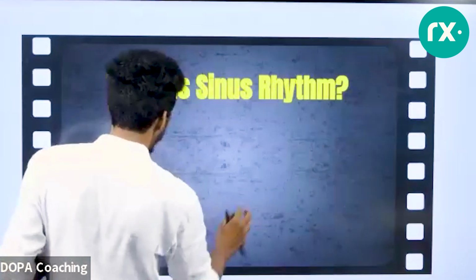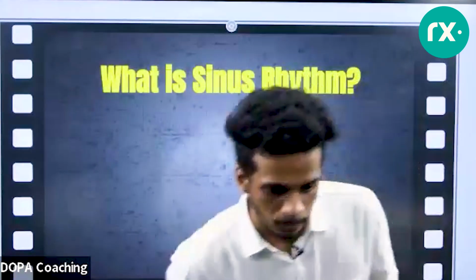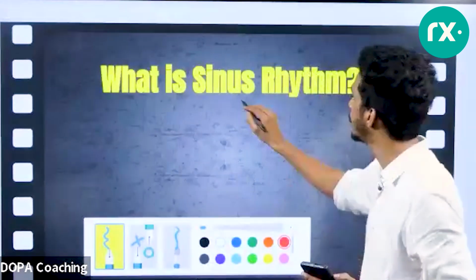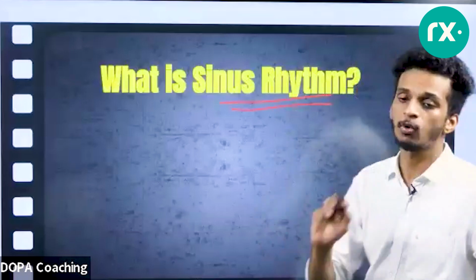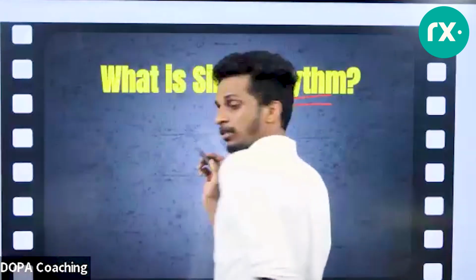So now let's move on. Now I'll be discussing what is a sinus rhythm, because these terms you will be hearing again and again while discussing ECGs. Sinus rhythm simply means one thing.